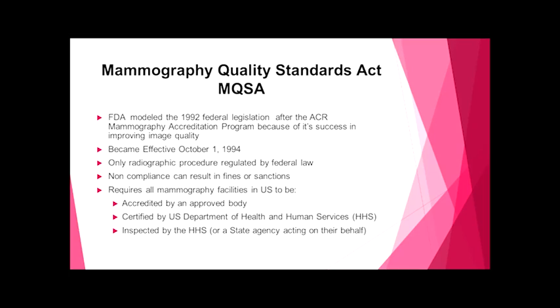MQSA requires all mammography facilities to be accredited by an approved body, then certified by the Department of Health and Human Services, and inspected by the HHS, or a state agency acting on their behalf.